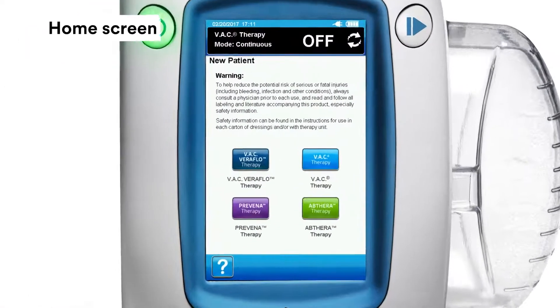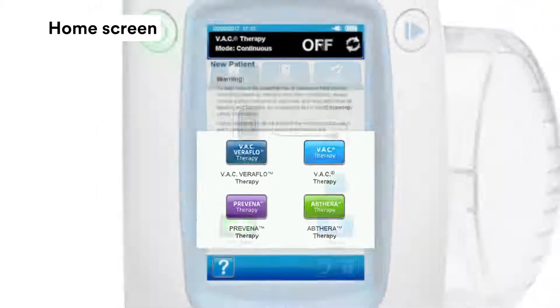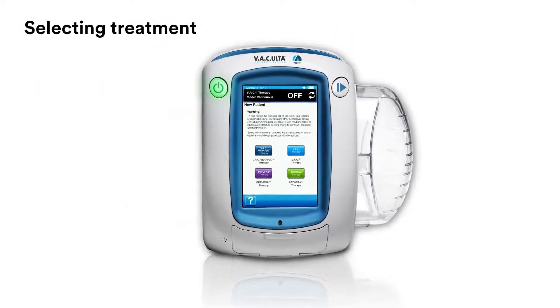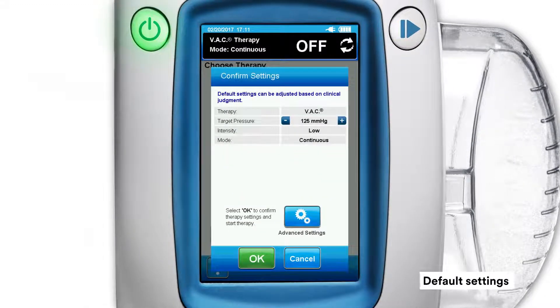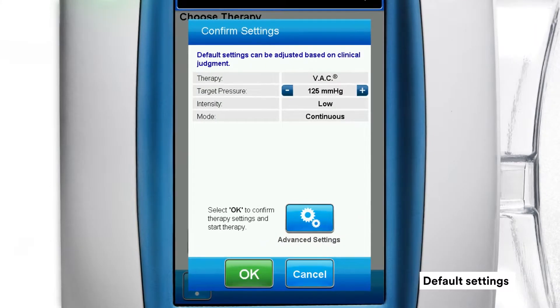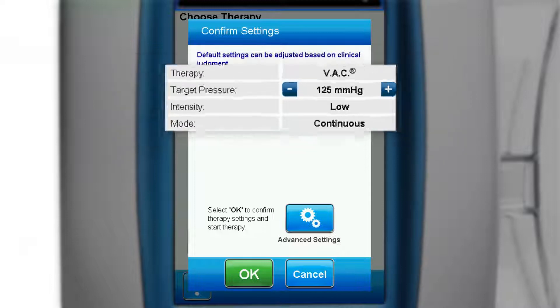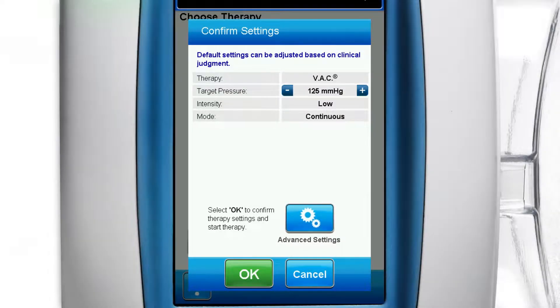The home screen includes four color-coded buttons, one for each therapy. When you initiate a therapy, that therapy's specific color coding frames the screen. To select a therapy, press the associated therapy button. A confirmation screen appears showing the therapy's default settings. You can use the plus and minus buttons to change settings if they are an available option. Settings that do not include plus or minus buttons must be changed using the advanced settings button. Advanced settings are not covered in this video.